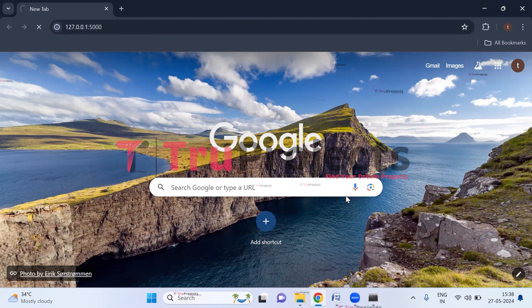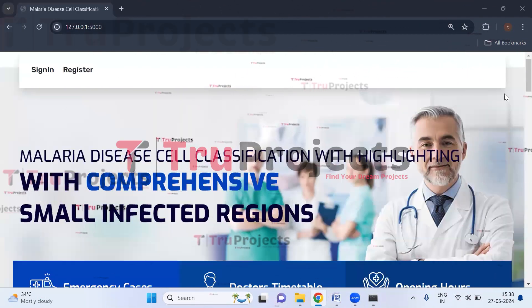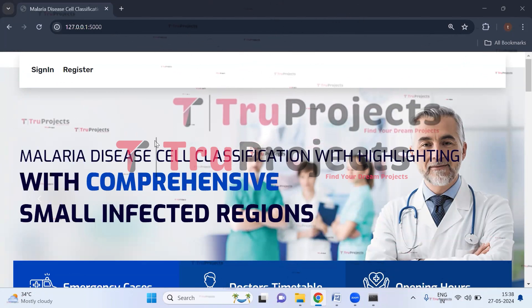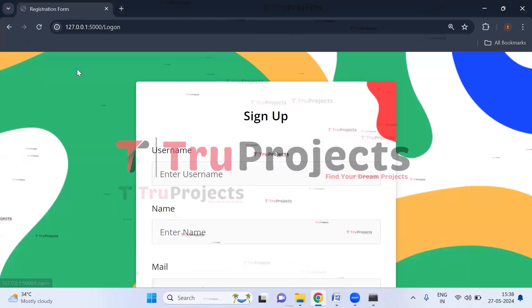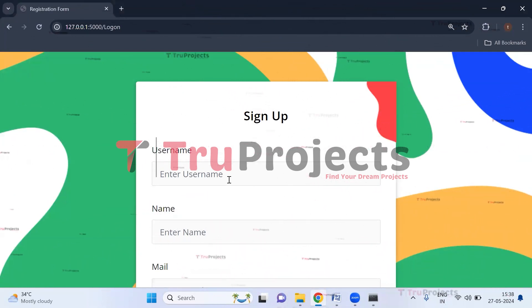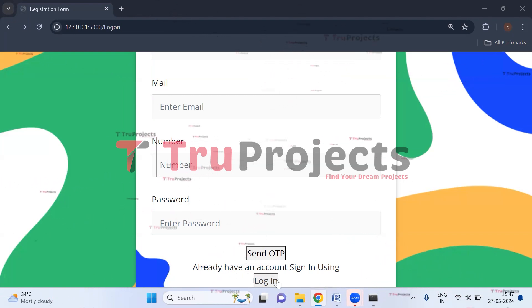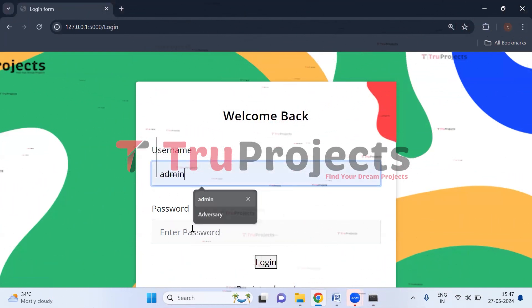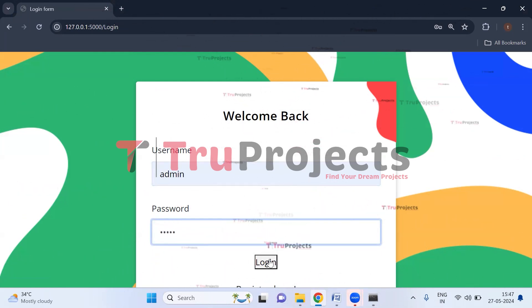The home page of the project is displayed in the browser — this is the front end built using the Flask framework. If you are a new user, you need to register first by clicking on the register link and entering all required details. Since I have already registered, I will click on the login button, enter the username and password, and then click login.